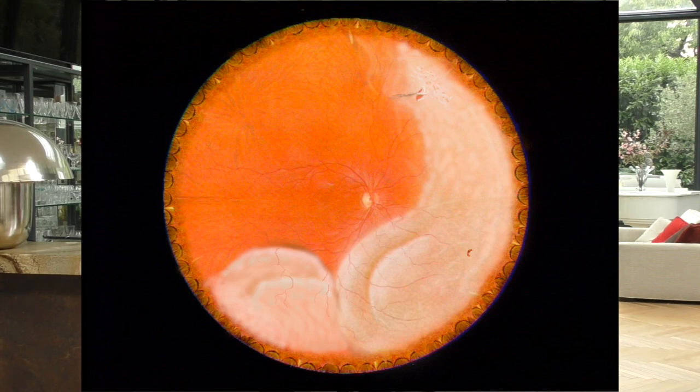Well, you have noted all the clinical details and your drawing is consistent with everything we have seen. You can therefore tell the story of this detachment. It is a detachment of a phakic eye, stage A. I saw 2 small tears, and I'm sure that there are no others. The first, on the posterior edge of this lattice at 1 o'clock, is at the origin of the detachment. It has a very tight vitreous traction which will have to be released. The second at 4:30 occurred secondarily, and the very relaxed aspect of the traction shows that it may not be mandatory to release it, especially since there is no circumferential fold and the posterior hyaloid seems to be detached all around.